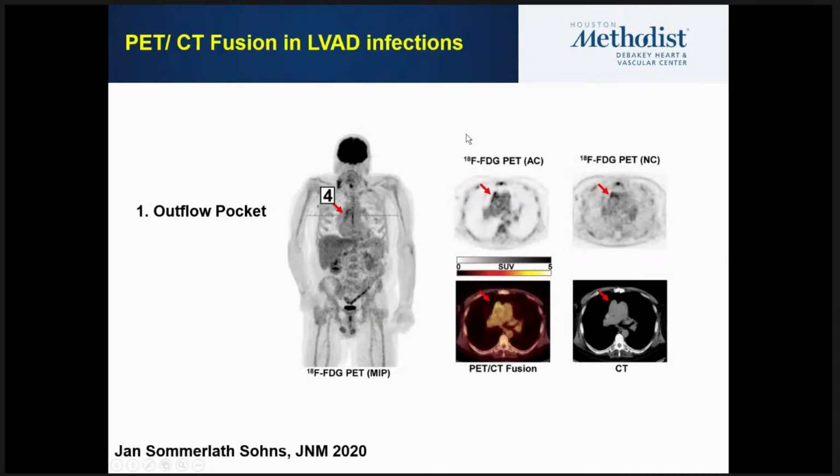We also not only look at prosthetic valves, but we also look at LVAD, and this is where PET adds significant incremental value over other imaging modalities, which have several limitations in assessing LVAD infections.